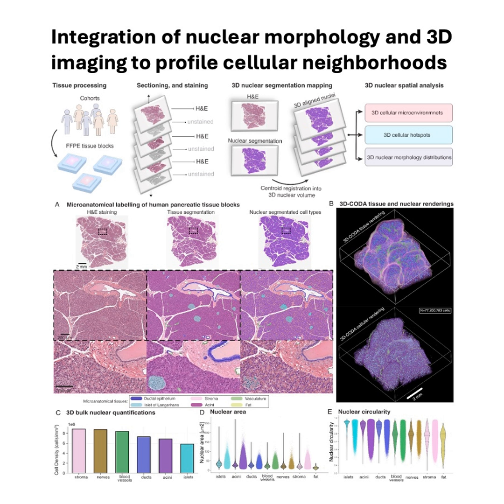Significantly more. And similarly, though maybe less pronounced, there was a moderately higher density near larger blood vessels compared to smaller ones. Whoa! So it's not just where the immune cells are, but their density depends on the size of the structure they're near. Precisely. A size-dependent inflammatory response pattern. Immune cells preferentially gather around the bigger highways, the major ducts and vessels. You would absolutely miss that in 2D, wouldn't you? Completely. You might see some cells near a duct, but you wouldn't have the context to know if it was a big duct or small one, or systematically compare densities like this. It's an insight only possible with this comprehensive 3D view.